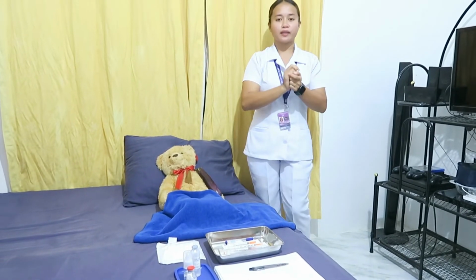After that, prepare the medication vial for drug withdrawal. In this procedure, mix the solution if necessary by rotating the vial between the palms of the hands, not by shaking. After that, remove the protective cap or clean the rubber cap of a previously opened vial with an antiseptic wipe by rubbing in a circular motion.